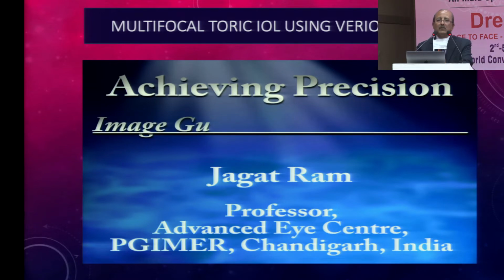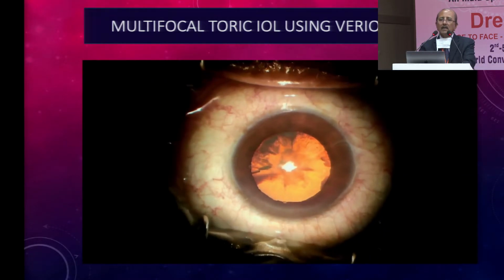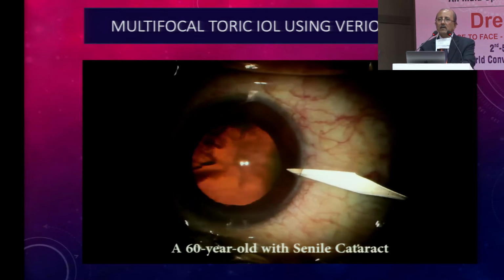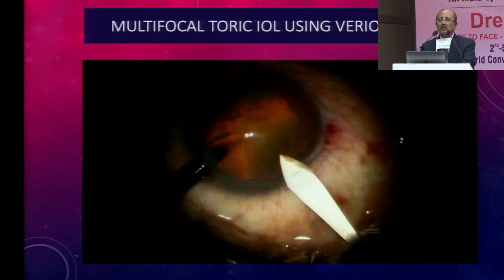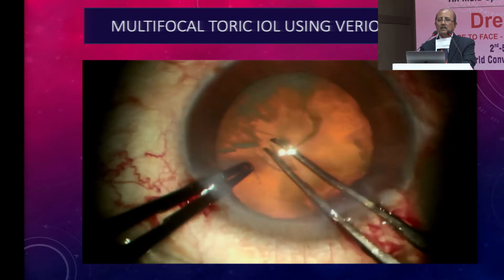I would like to show a few of the cases where we have used it for toric as well as for multifocal IOL implantation. This is one such patient.